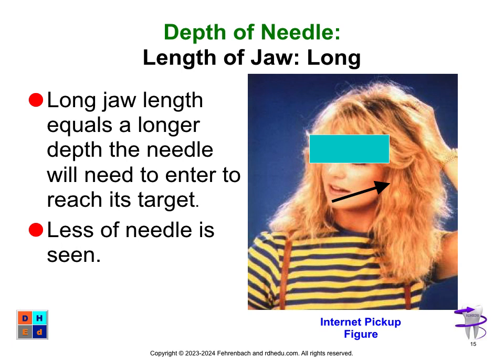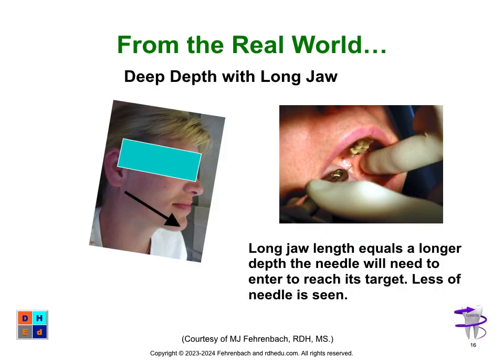Again, that's an internet pickup. Notice I protected the identity of the actress. Here's real world: deep depth of a long jaw, an incredibly long jaw. I think it's actually longer than the actress that we just had. So long jaw length equals longer depth the needle will need to enter to reach its target. So you're going to see less of the needle.